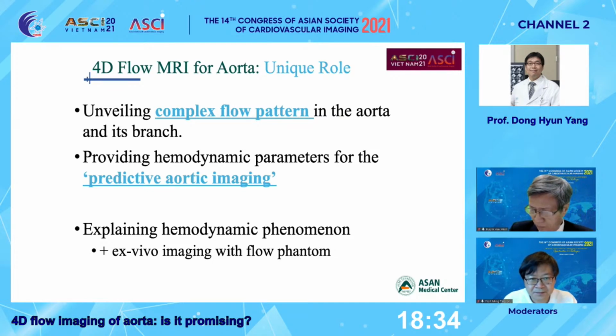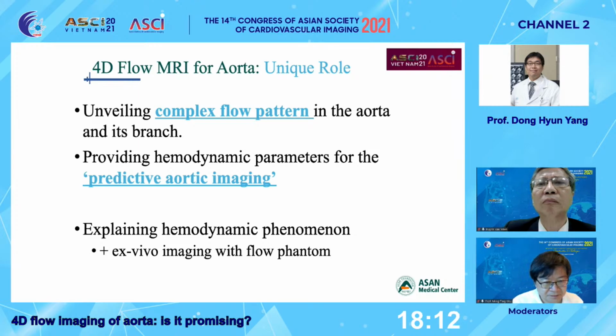And second, 4D flow MRI could provide hemodynamic parameters for predictive aortic imaging. And finally, 4D flow MRI could be helpful for explaining hemodynamic phenomena. Today, I would like to explain these unique roles of 4D flow MRI in my talk.